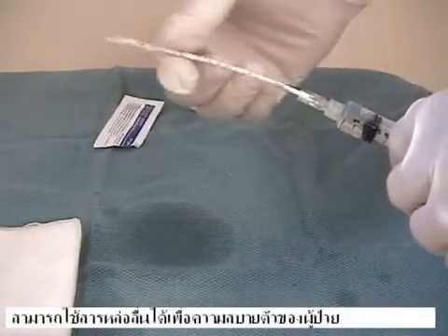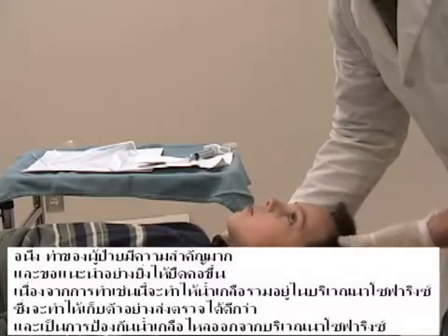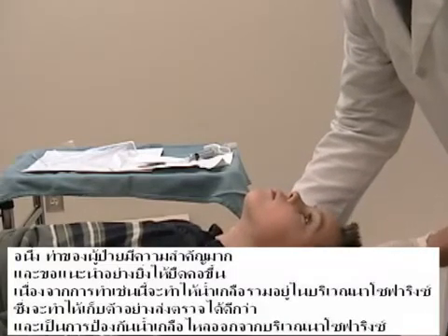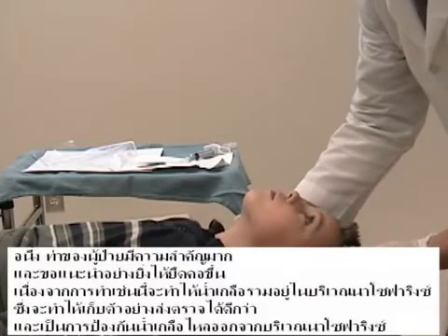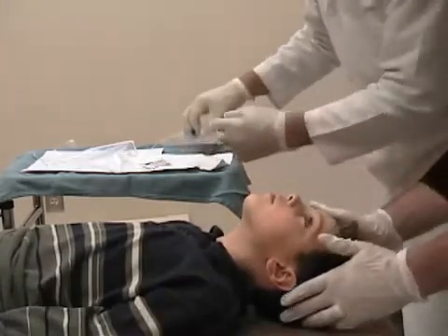Lubricant can be utilized for patient comfort. Again, positioning is very important, and neck extension is strongly recommended as this maximizes the pooling of the saline in the nasopharynx, giving a better sample, and prevents saline from leaving the nasopharyngeal area.